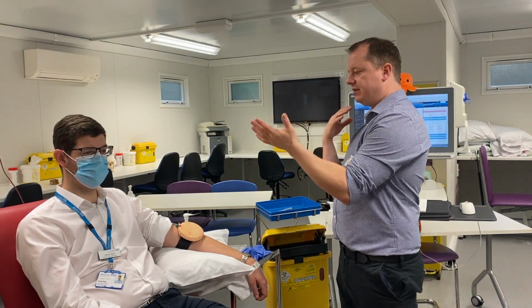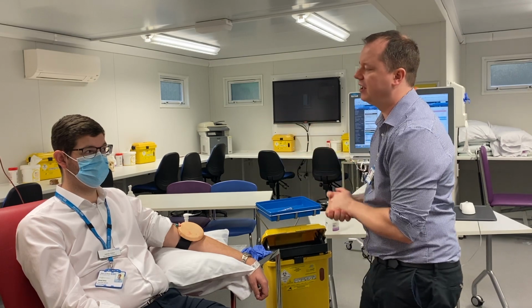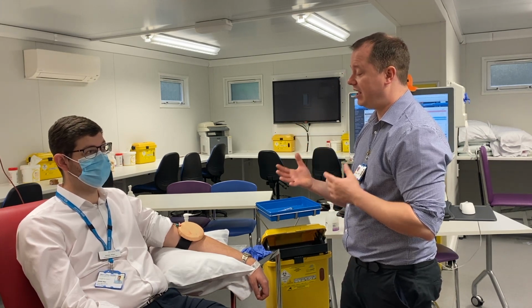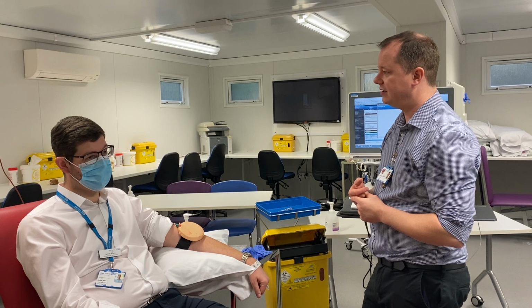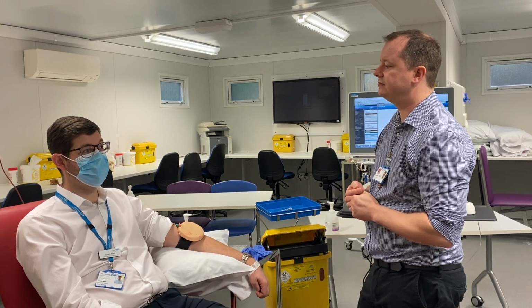What I'll do now is introduce my patient and make sure I identify them correctly. Hello, my name's Tom, I'm a nurse, I'm here to take a blood sample. Is that okay if I do that? That's fine. Have you had one done before? I have. Okay, brilliant. Before we get started, can I just take your name and date of birth, please? Yeah, my name is SimDemo1 and my date of birth is the 1st of January 1968.